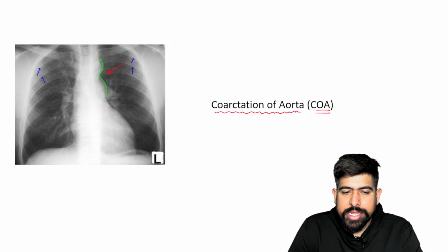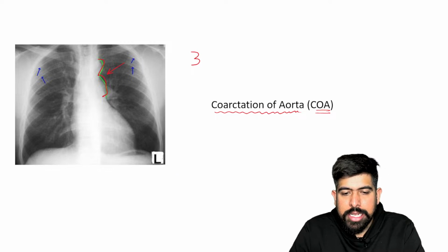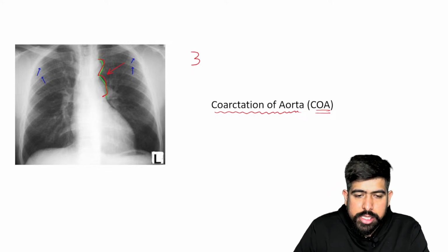This sign is known as your three sign. Can you see? We are seeing the three is there. Yes, it is looking like the letter three. So it is known as your three sign.